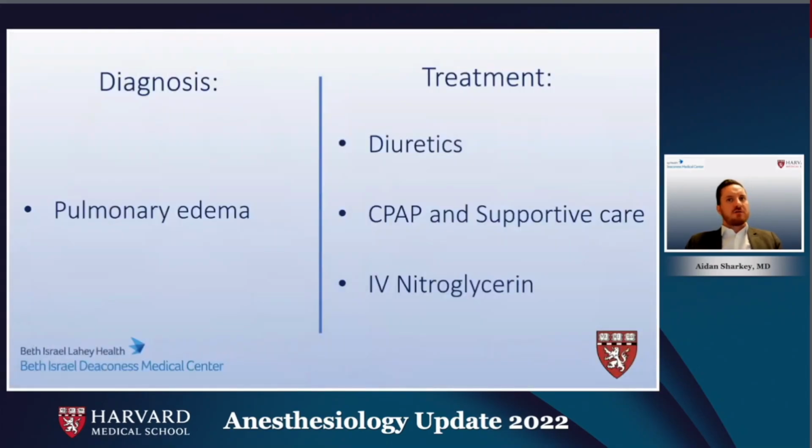Using our knowledge gained from lung ultrasound, we were now very quickly able to accurately diagnose post-operative pulmonary edema in this patient and subsequently commence therapy in the form of diuretics, CPAP, and IV nitroglycerin. These medications had a good effect, and the early intervention saved this patient from being reintubated in the PACU later that night. The point of care nature of lung ultrasound in the diagnosis of pulmonary edema is really highlighted in this case.